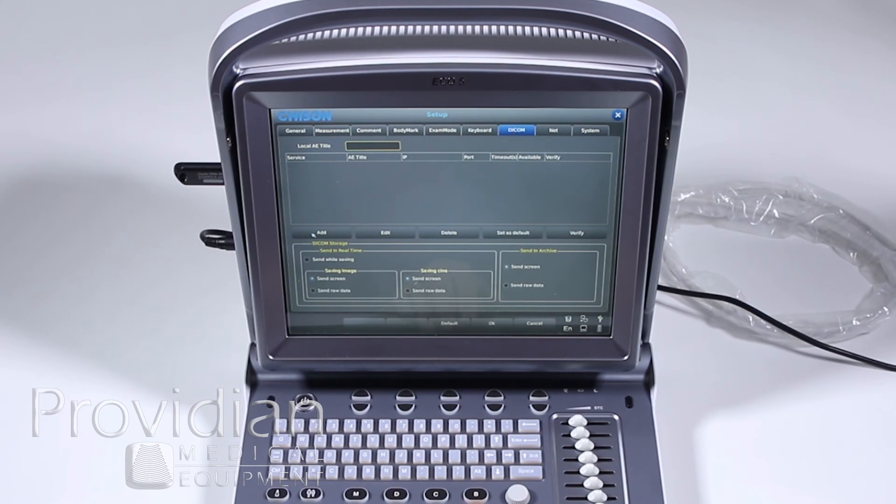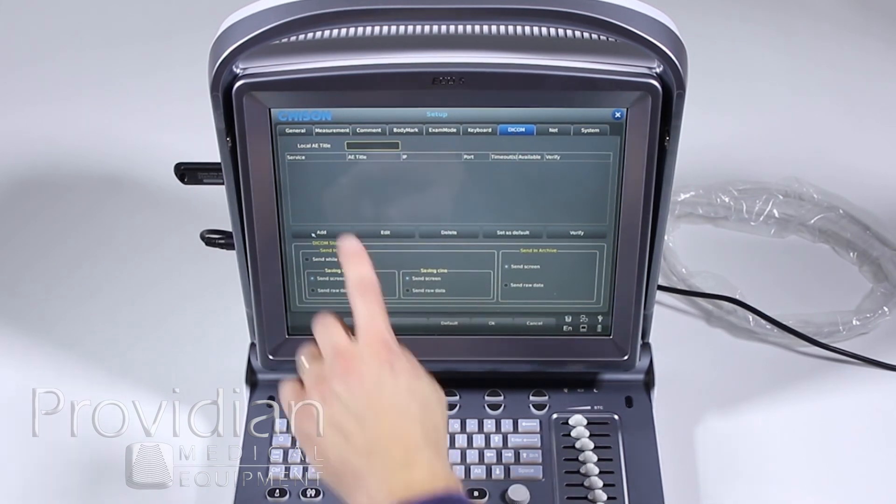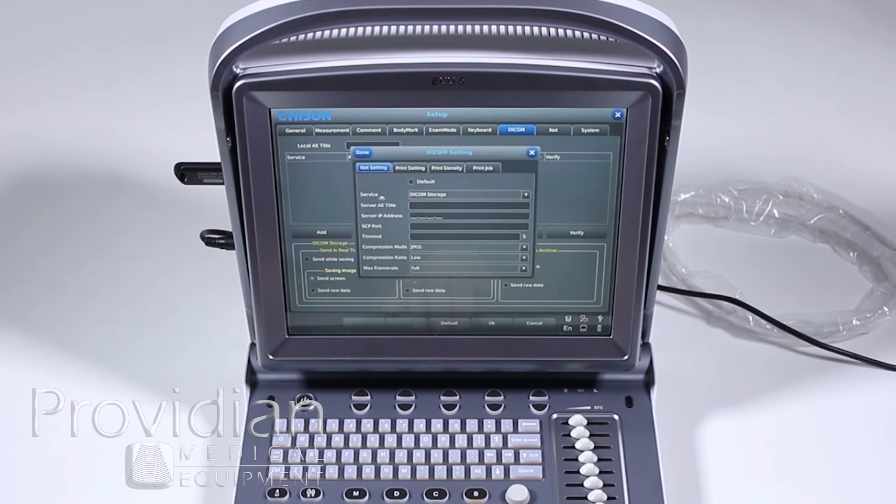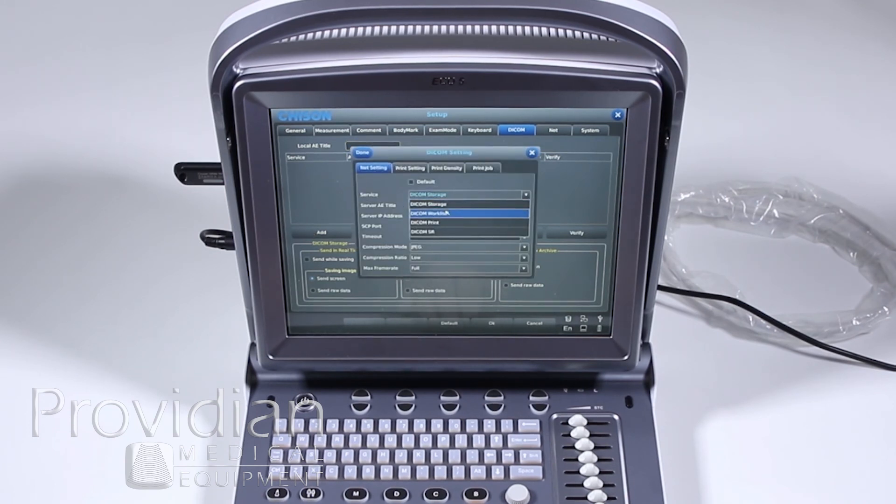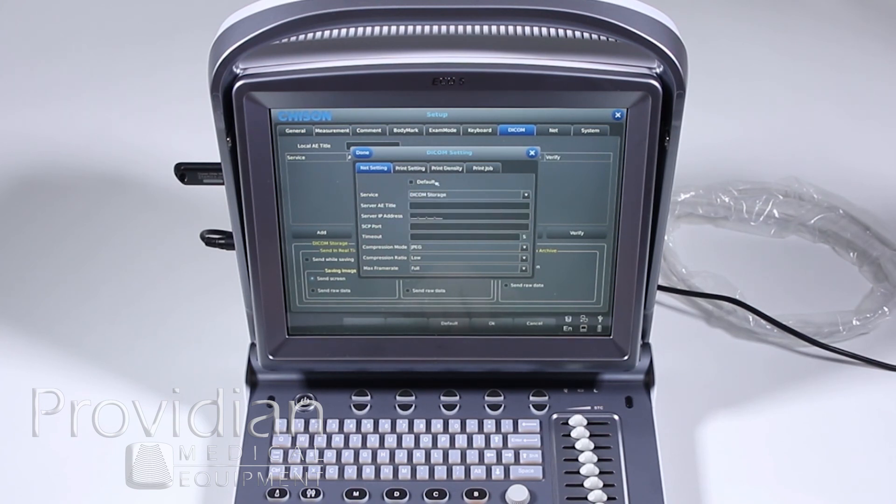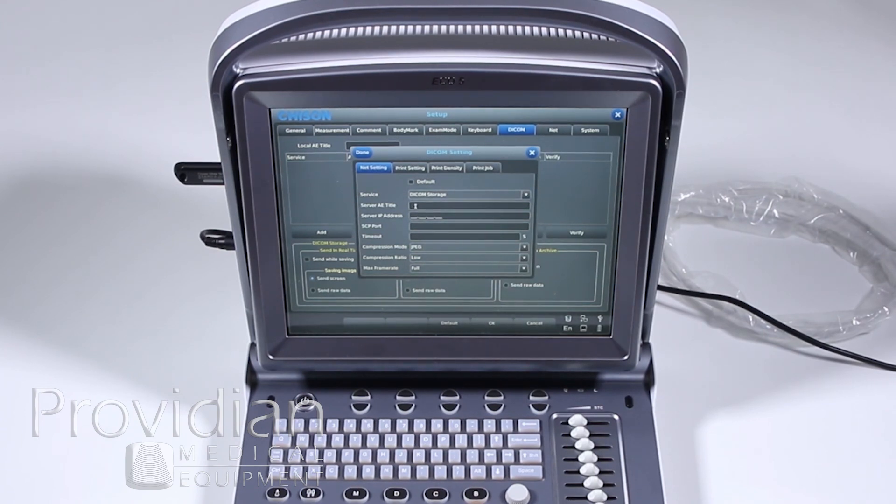In order to do that, you have to add a service by clicking add. And it's going to give you a drop down here. You want DICOM work list, print, store, or SR for structured reporting. And you want this to be the default service that it goes to. This is only information you can receive from the person who runs the DICOM server.